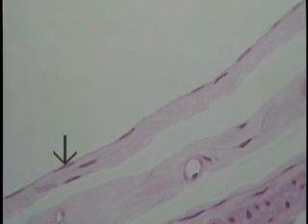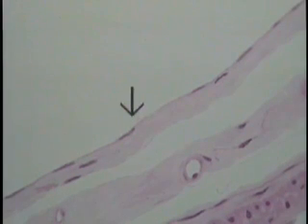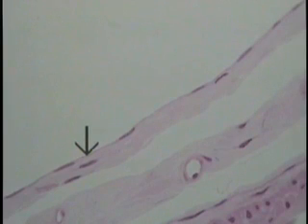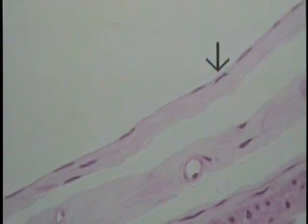The nucleus of one squamous cell is located here, the next one is located here, one is here, and one is here. This very thin interface extending to about here shows you the extent of its cytoplasm. So these are very flat, plate-like cells. I'm trying to draw with the tip of the arrow the depth of this particular epithelium, and you can see the cytoplasm blurs between nuclei.